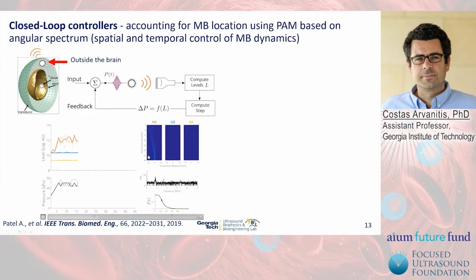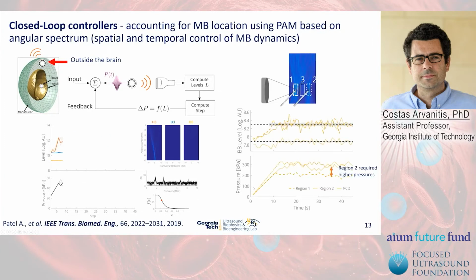Using this method, we are now able to control the microbubble dynamics using a region of interest in the passive acoustic map that also uses specific spectral components in order to reconstruct the acoustic field. And we are able to sustain and maintain stable cavitation in these in vitro experiments.